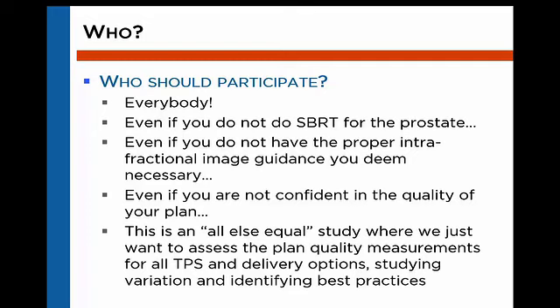And in this particular plan study, it's the first time ever we're going to be estimating or quantifying the delivery time. We're going to do that as the beam on time. So not only will we be able to study the plan quality, but we'll be able to estimate what would be the delivery time. And for a hypofractionated prostate case, of course, the delivery time is of great importance.